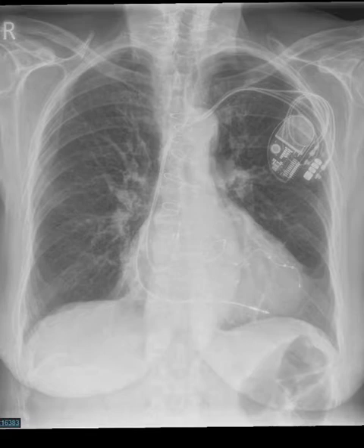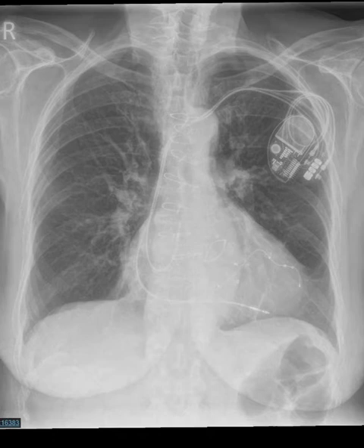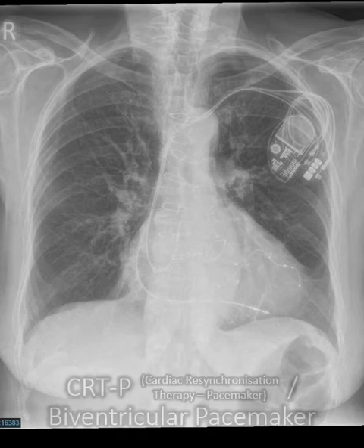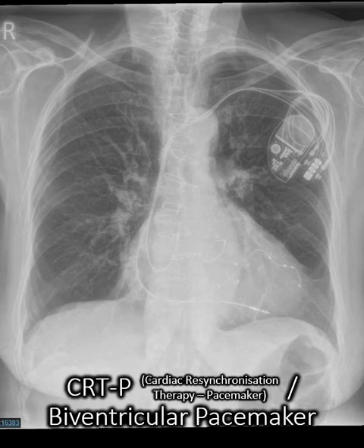How about this one? We can see there is a quadrupolar lead going to the left side of the heart. We can see that there's an atrial lead and a right ventricular lead. There's no thick coil on it, so it's a biventricular pacemaker.